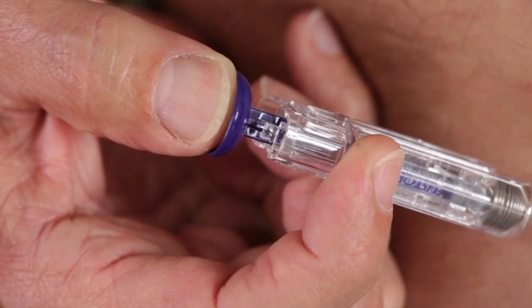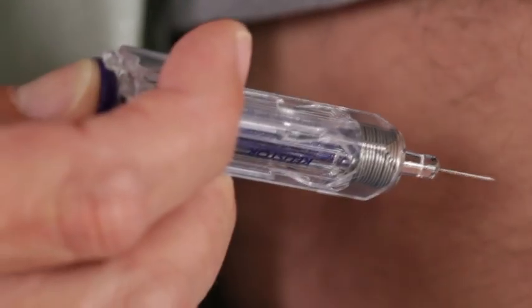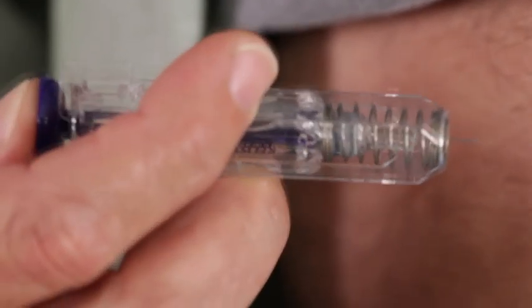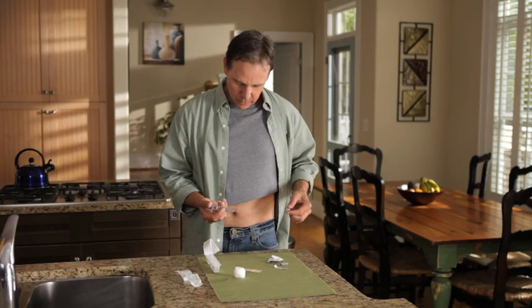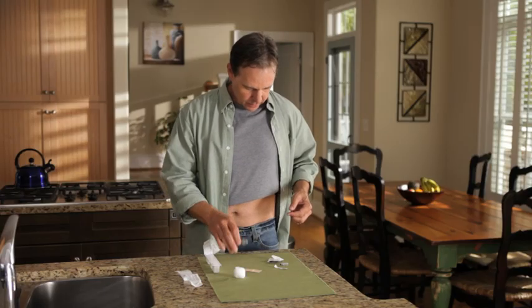Now let go of your skin and slowly push down on the plunger with your thumb until the syringe is empty. This will release the needle safety device. Continue to hold pressure on the plunger with your thumb and quickly pull the needle out of the skin. And be careful to keep the needle at the same angle as it was inserted. Then remove your thumb from the plunger to allow the protective sleeve to cover the needle.